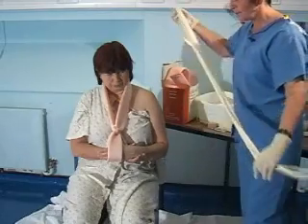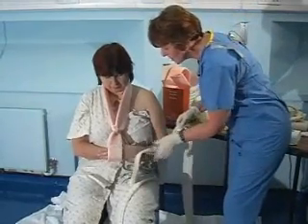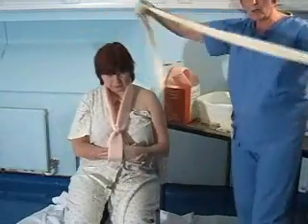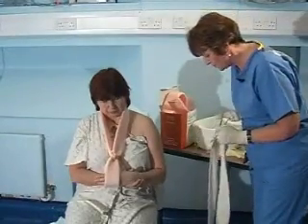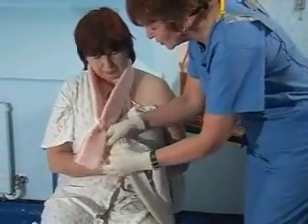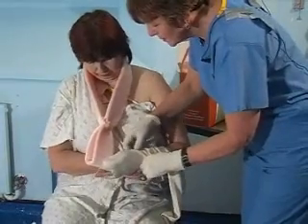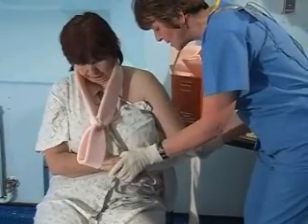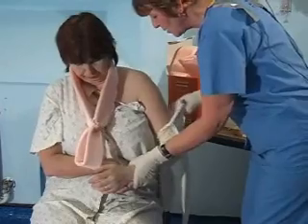I cut a stockinette — a big size is always available in A&E. We don't usually use it for arms like below-knees because this is temporary. So I measure a long length and thread it through very gently with the patient's help. You hold on your hand a minute because otherwise hanging the arm down will move the fracture. You should really have two people doing this so that one person is behind controlling the arm, so the patient doesn't have to do this herself.